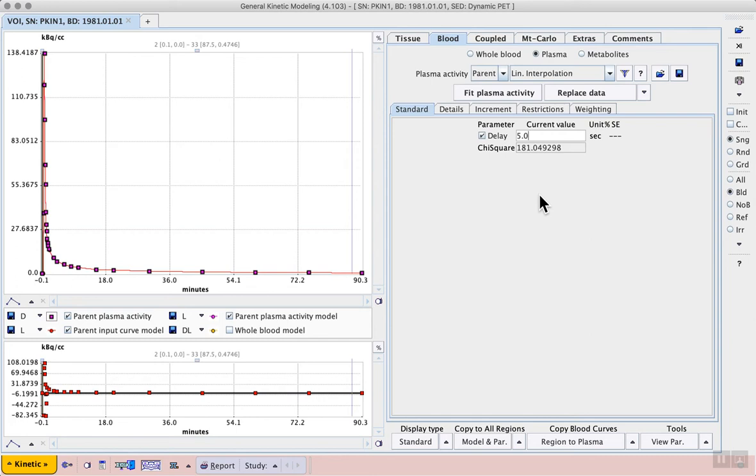Now that we have the required blood data and we've adjusted the delay, we can go back to the kinetic modeling process.